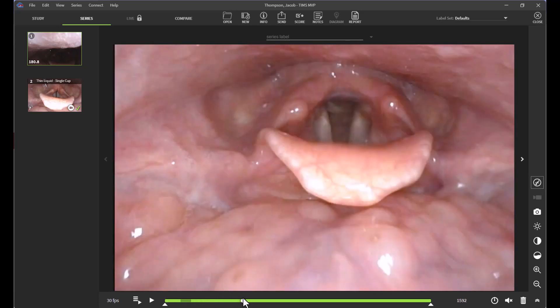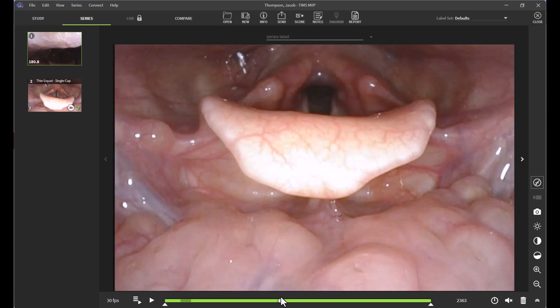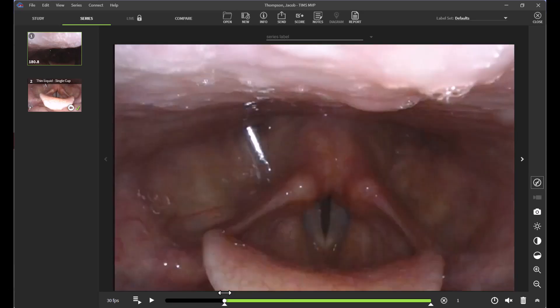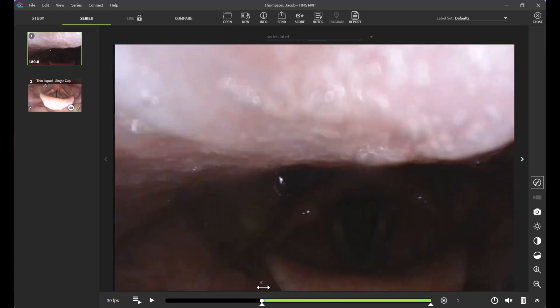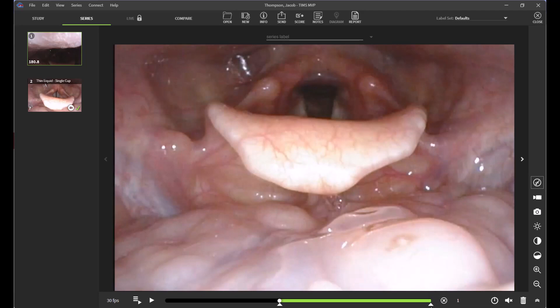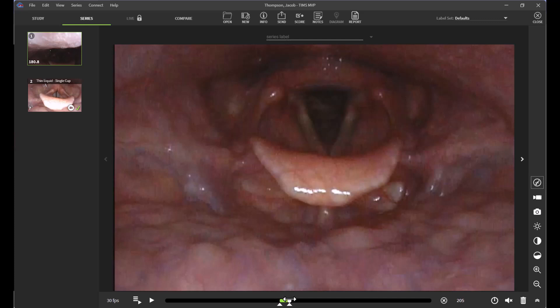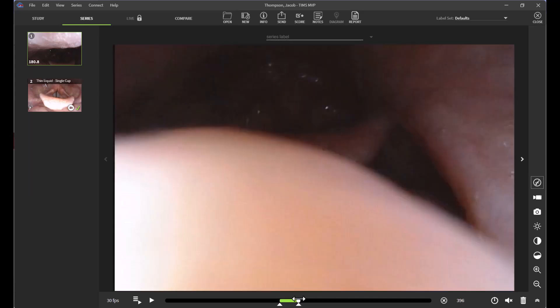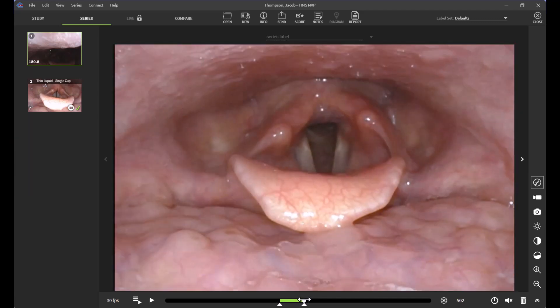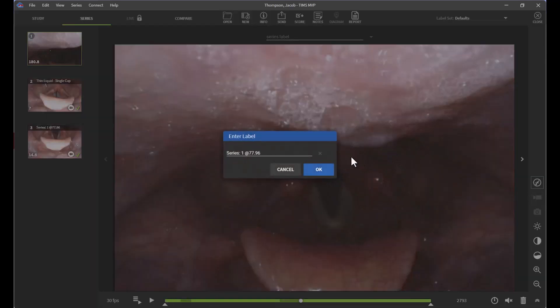Let's say I want to create a subclip later on in the study. I'm going to drag my triangle for this trial, stop right there, and then drag my other triangle back towards this trial and swallow. Let's say I want to stop my subclip there. Again, I'm going to click my camcorder icon and label my subclip.